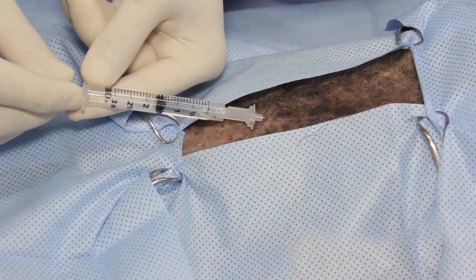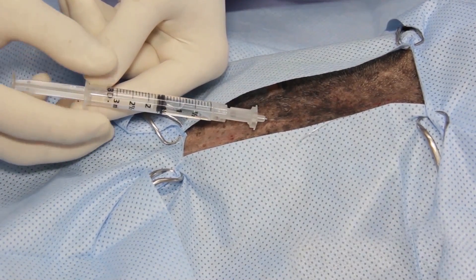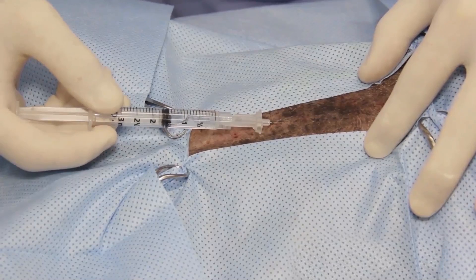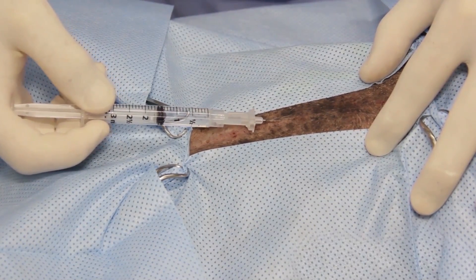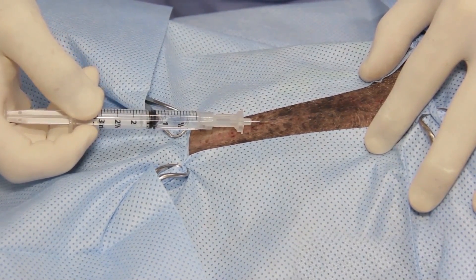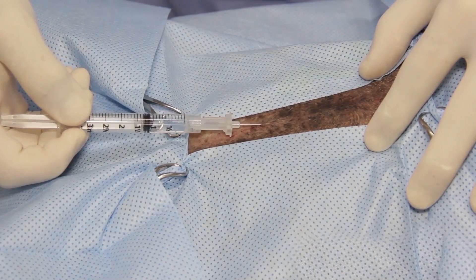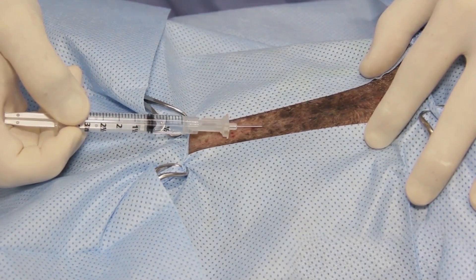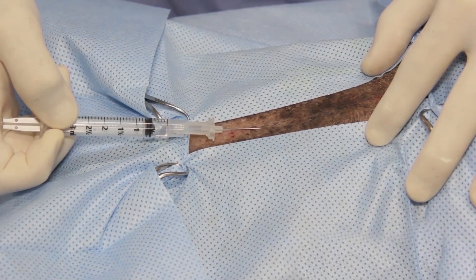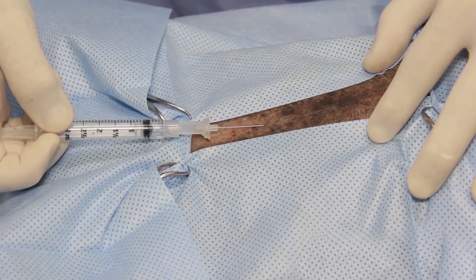But it can also be applied in skin sutures, before chest tube placement, and other surgical procedures. For a laparotomy, local anesthetics are injected into the subcutaneous tissues along the linea alba, either just before the final aseptic preparation or in the incision by the surgeon, or alternatively after the incision has been made in the skin and subcutaneous tissues.